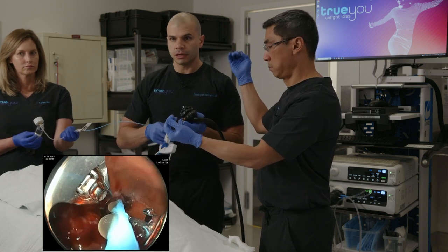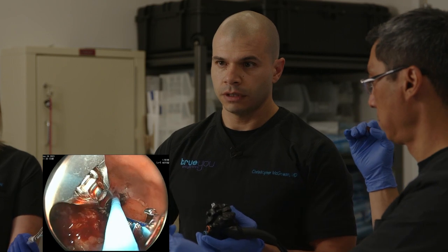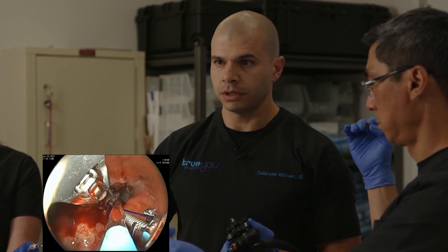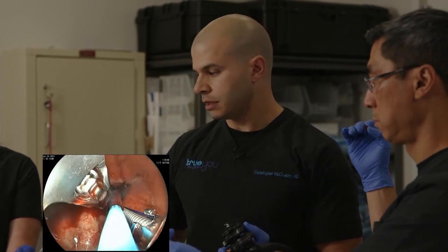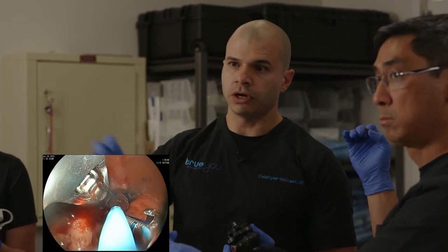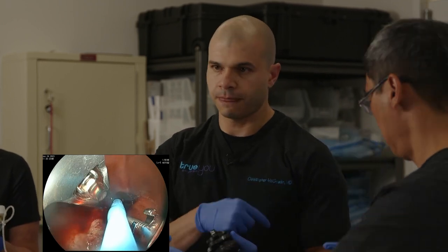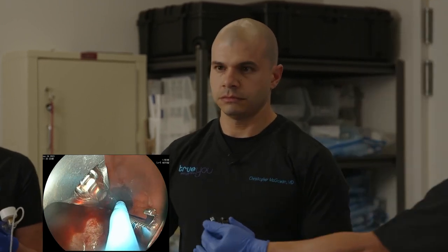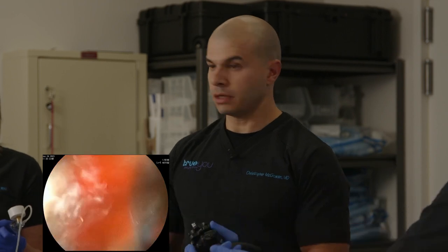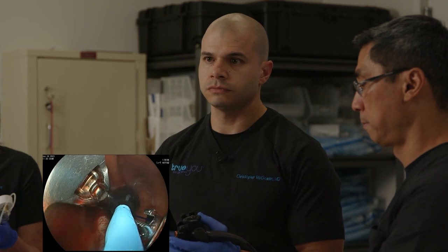So I'm feeding this cinch through, positioning it at the anastomosis. And then we're going to inflate our balloon to 8 millimeters, which is 10 ATMs. So this balloon is across the anastomosis, ensuring that we don't over-tighten. And just let me know when that's there. We're good, okay. And then I'll tighten the suture.